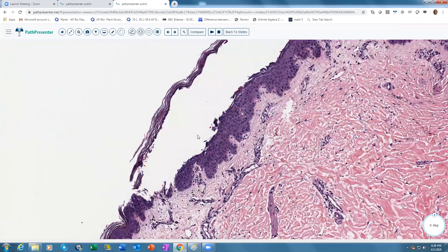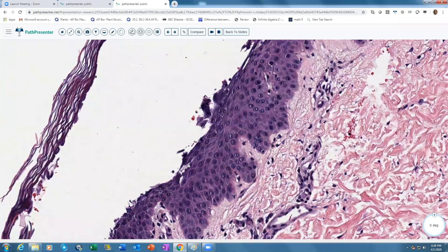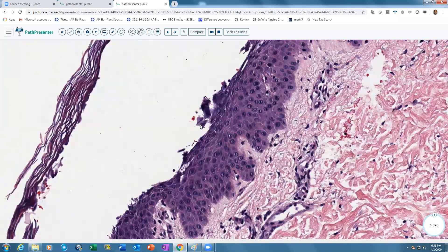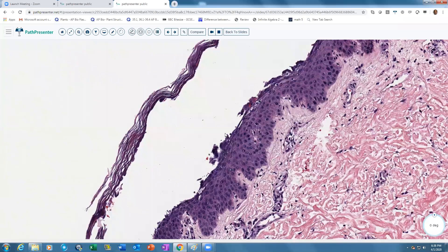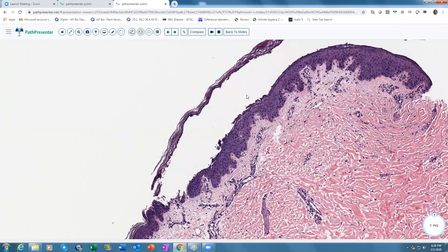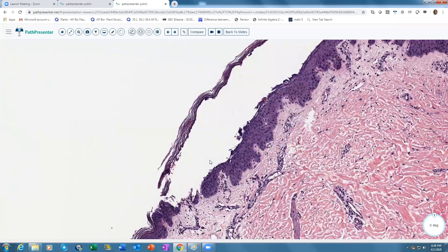We see a few acantholytic cells floating within the bulla — keratinocytes that are completely split off. Overall it is a very clean split: not too much inflammation, no neutrophils, no eosinophils. There may be some red cell extravasation, but it is essentially a very clean split.